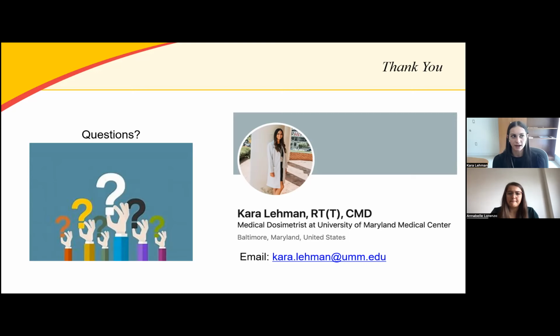Yeah, so I don't think we have anything specific for SDX that's out of what we would have for any patient that we're planning. There's a few gantry angles that we cannot use for treatment planning. But the only thing I would mention, that I mentioned briefly during the presentation, is that we try not to have any couch kicks if possible, because it's a lot simpler for the therapist and a lot more reproducible in terms of obtaining images if the patient stays without any couch kicks. Okay.